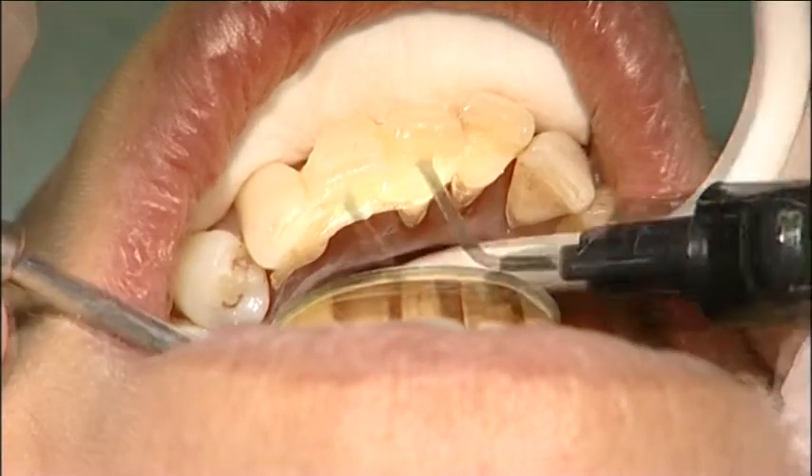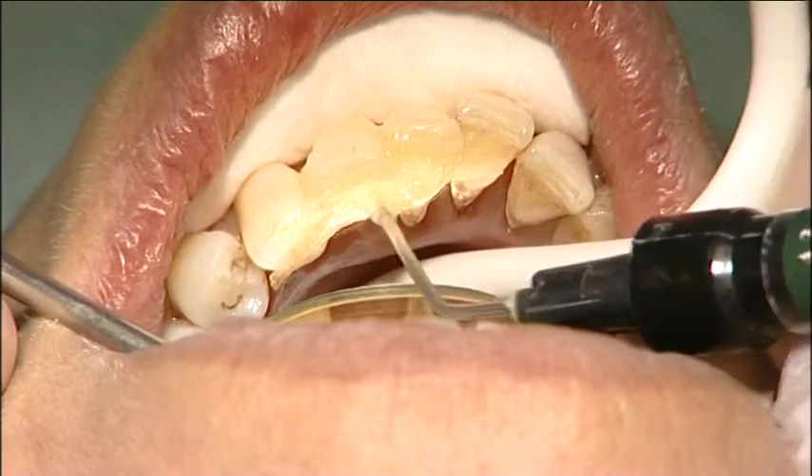The splint was covered with a continuous layer of flowable composite. The splint was then light cured for 40 seconds, one tooth at a time.